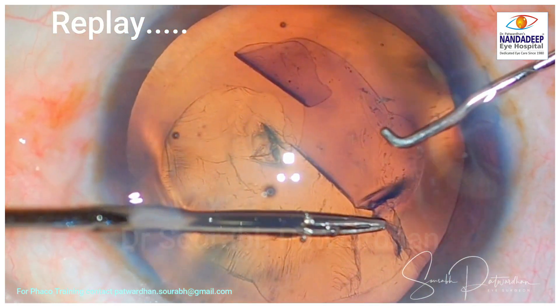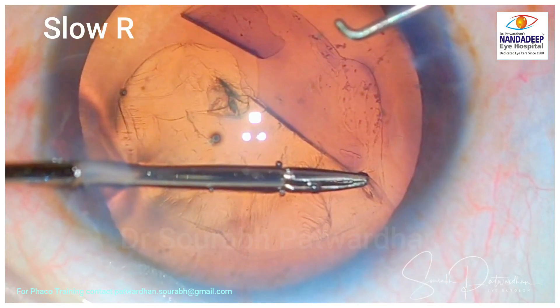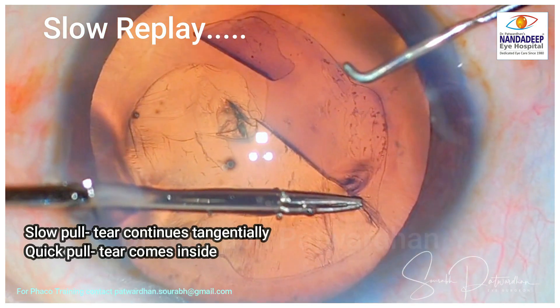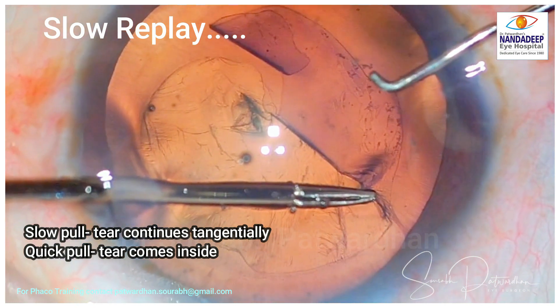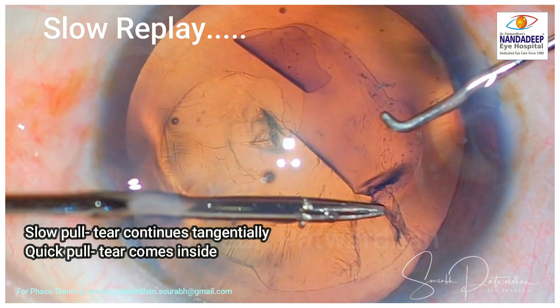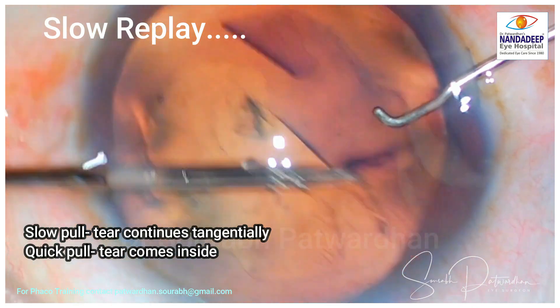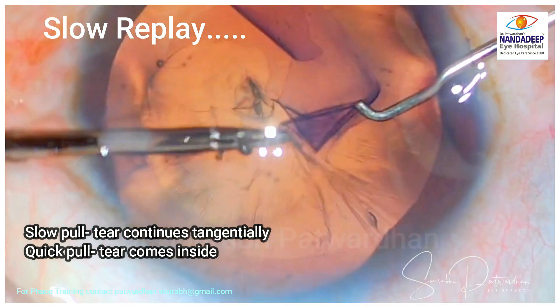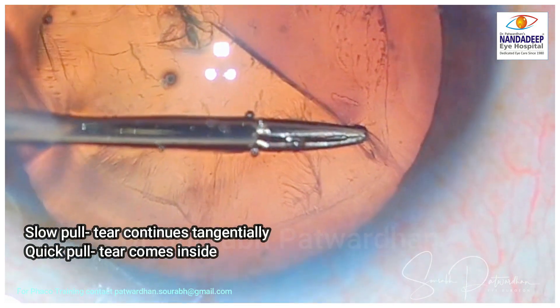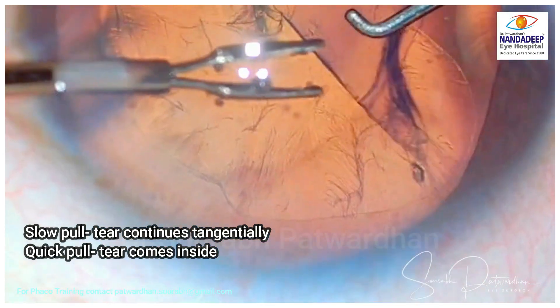A quick pull will balance the zonular force in a much better way. If you try to pull gradually, the tear still continues to go tangentially outward. With a quick pull the tear comes inside — you can watch closely as the surgeon pulls more swiftly and the tear comes inside.